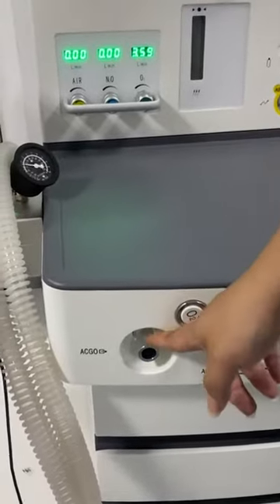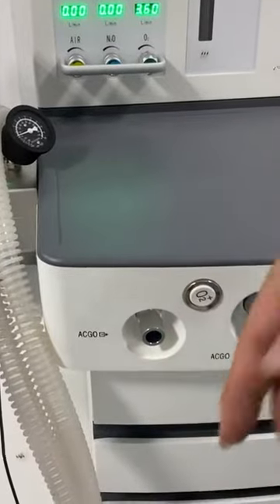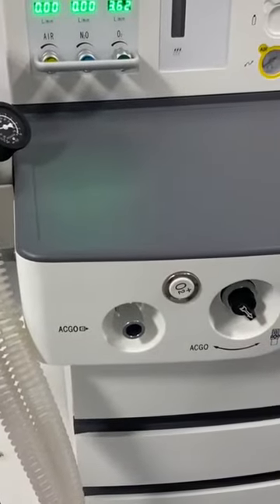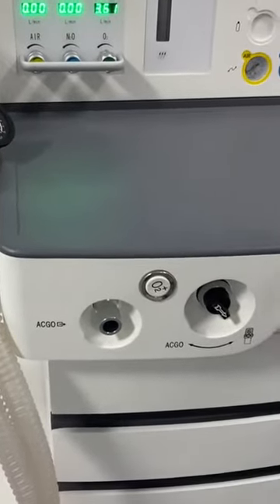But if we have this ACGO pod, the gas can still come out from the ACGO and keep the patient breathing, and we can still finish our operation. So the patient is very, very safe.